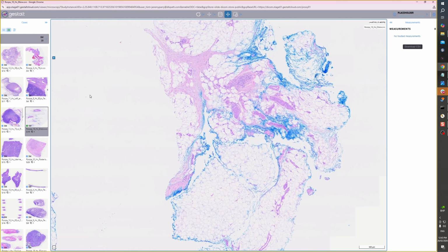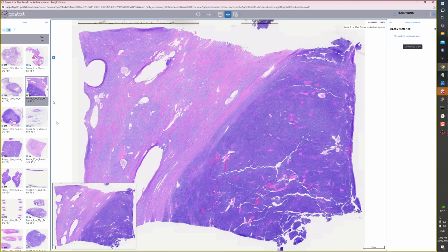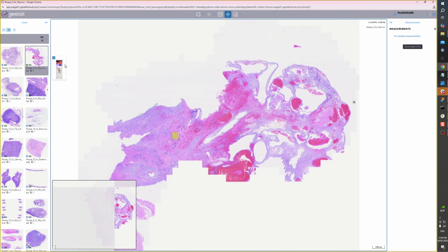And then by minimizing the image of the tissue, you create a preference such that when you drag across another image, that stays hidden, but the positional overview will reopen each time. That's just a user preference. But you can reopen them, and if you reopen the tissue on the slide image and drag another image across, that'll stay open, but I want to close it, so we're going to close it.